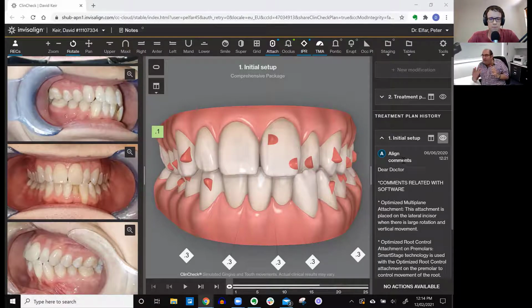What is our boundary with the tooth movement? So I'm assuming your upper center line is correct. I mean, we can look at your extraoral photographs, but I'm assuming that, and if that's the case, your lower center line is now shifted significantly to your left-hand side. So you've got a minimal overbite and you've got a crossbite on the 2-2, but your 3-2 is significantly labially positioned. And when we look at your intraoral photos, you've got significant recession of that 3-2.